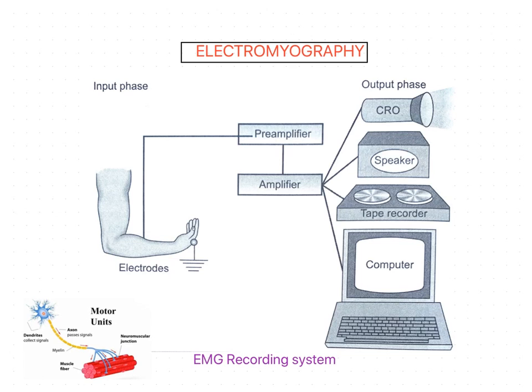The test usually involves observation of muscle action potentials from several muscles in different stages of muscle contraction. This test should also be integrated with other methods of assessment such as muscle strength, sensory tests, and tests for reflexes to come to a clinical conclusion.